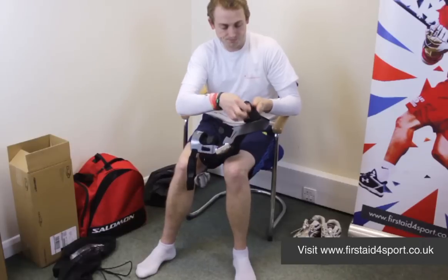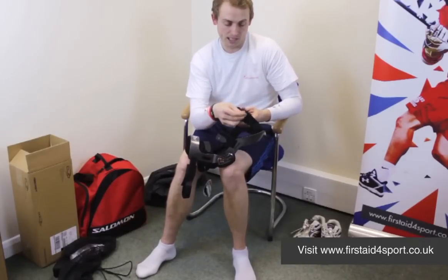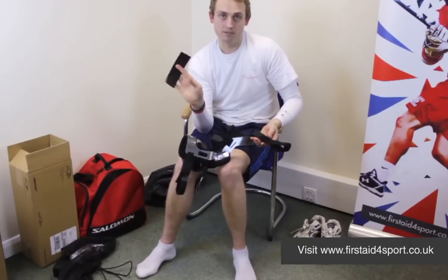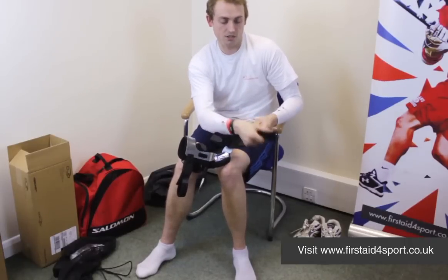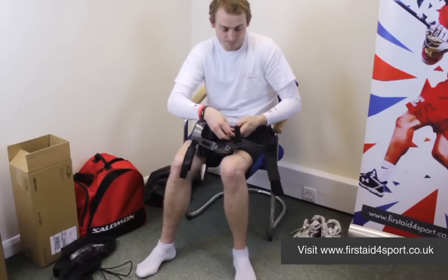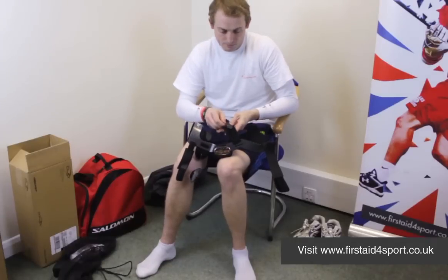A tip that we use at First Aid for Sport: when you're taking the straps off, stick them back down again — it just makes life easier. On the back of each of the pads, there's just a comfort strip, which is a bit of chamois leather with Velcro on it. It also stops the brace slipping and moving.